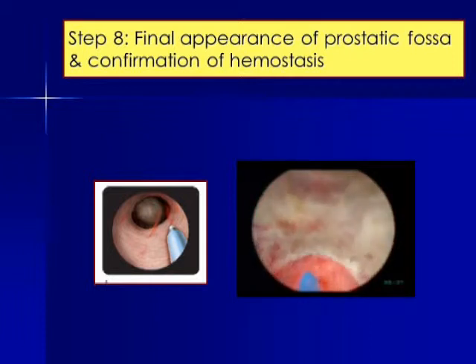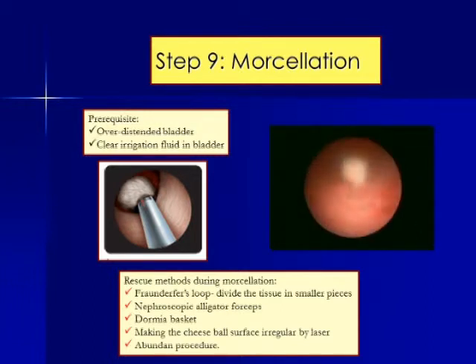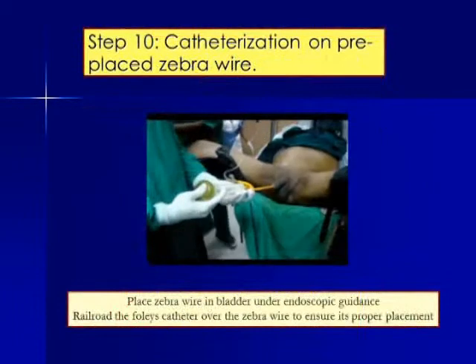It is always a wide fossa, but it may not be very clean. It appears that surfaces are rough or irregular, but this doesn't really make any difference in the outcome of the patient. This is followed by morcellation with a morcellator. Most important thing is to have a clear vision, a good hemostasis, and absolutely distended bladder by using both inflow and outflow of the nephroscope to fill the bladder, because morcellator itself has a suction which will suck the fluid out of the bladder.